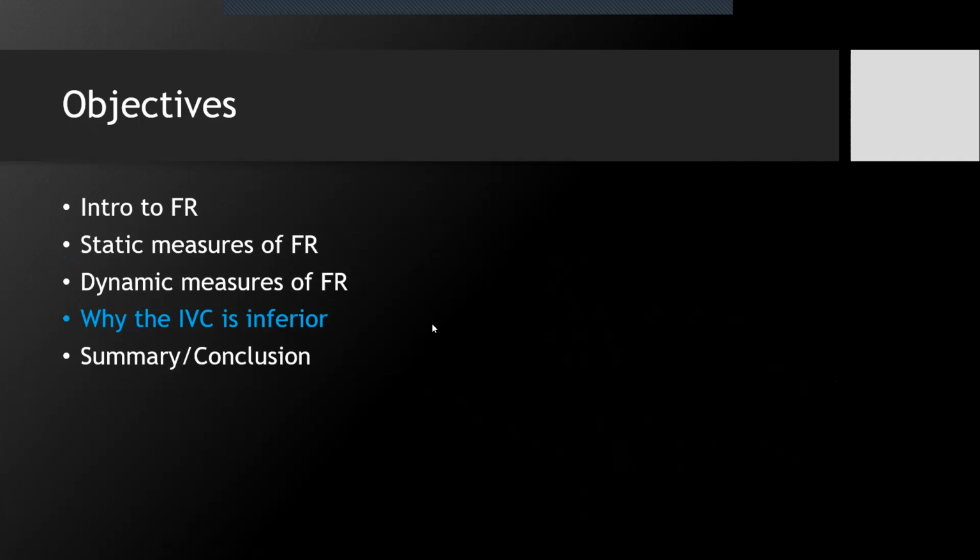And so now I'm going to launch into why I dislike the IVC so much for fluid responsiveness. And part of it, I think, is also because it's so easy to do that it's so tempting to rely on it. But hopefully in the next few minutes, I'll convince you not to do that. The first issue is something that I already alluded to, which is just confusion regarding variability and what it means. This is not insurmountable, but there's very poor data overall. There are many different studies with many different cutoffs.